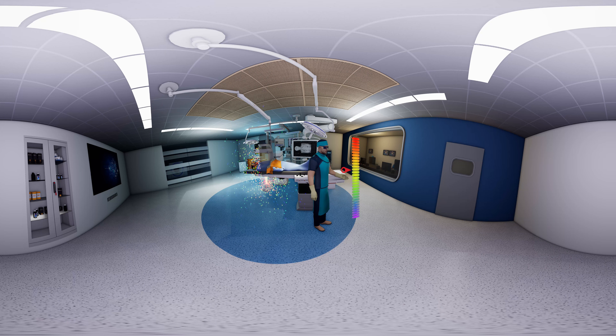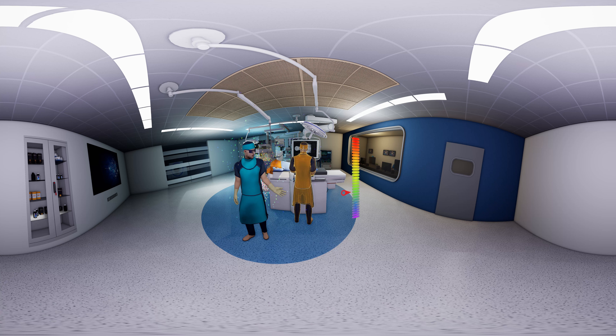As you can see, the radiation dose is still high from under the table. To reduce the exposure, let's mount the UT70 lower body protector on the table rail. This will give enough protection for two users around the table.